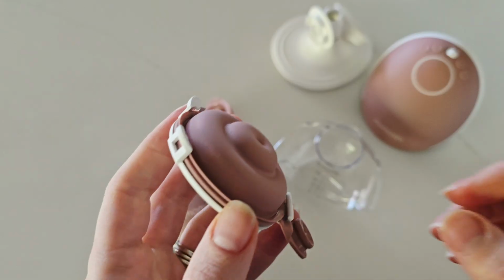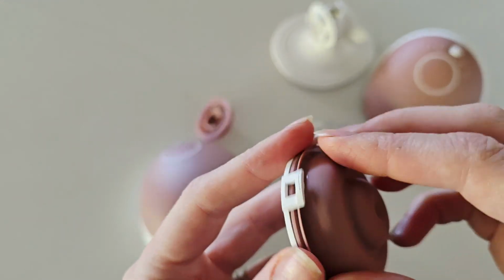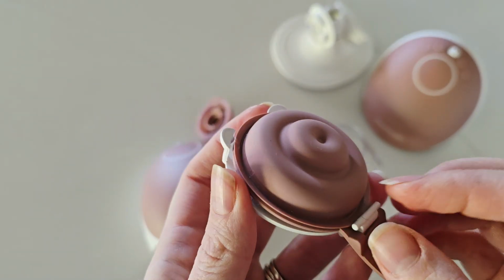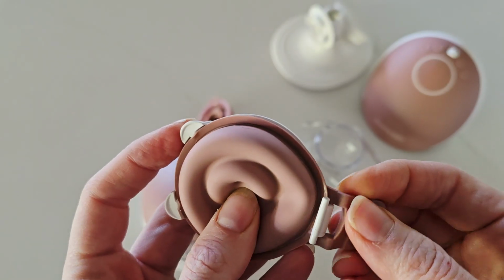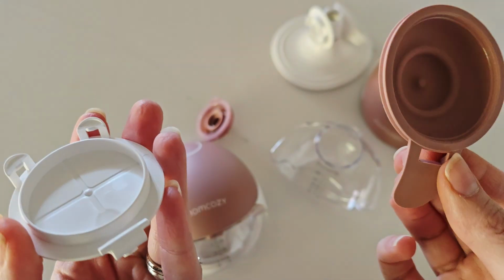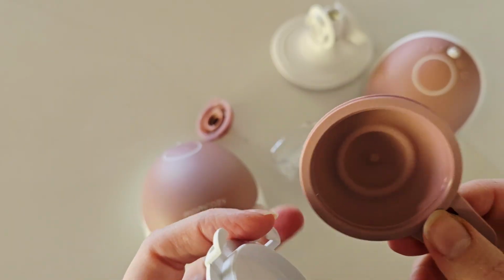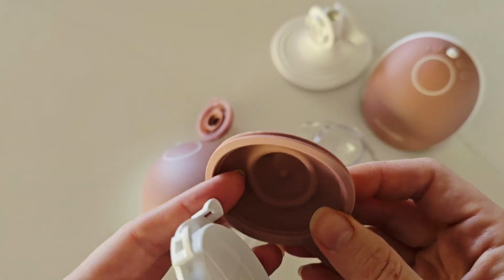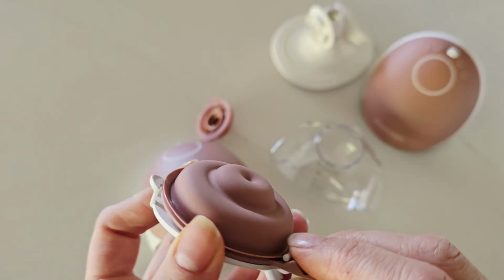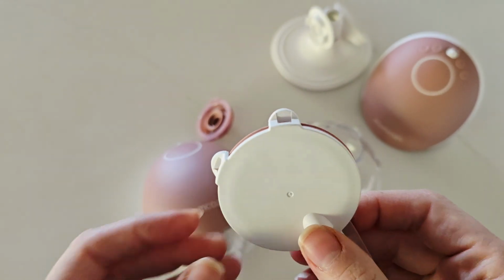Now, on the Momcozy site, they do recommend that you do not remove this part here for washing and cleaning. They recommend having it like that, and that's just so that you don't damage this part any further, because it is quite flimsy. So personal choice, given that it comes in contact with breast milk, I prefer to separate it, but that will mean that it will possibly wear a bit quicker. So if this stretches out of place, discolors, you get any scratches, it will need to be replaced. So every 2 to 3 months, you are looking at replacing your diaphragm. Again, your usage will come into play.